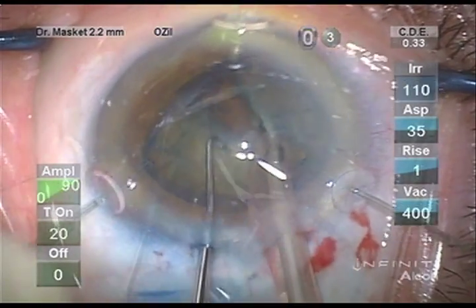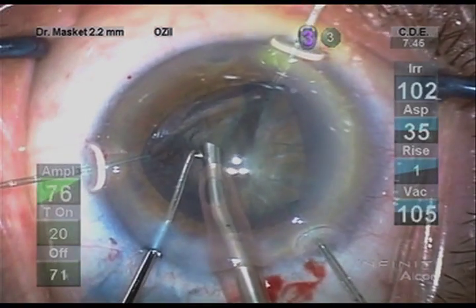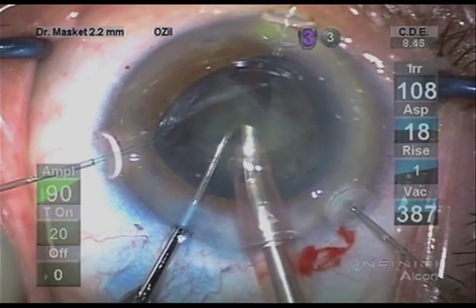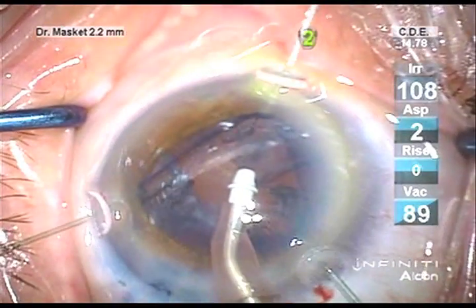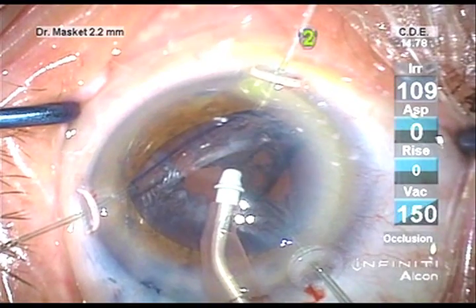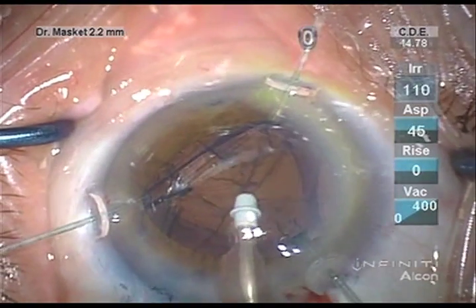Given that the hooks support the capsule, I can perform my standard CHOP phacoemulsification without further weakening of the zonules. Nuclear emulsification is carried out routinely. I opted to use a coaxial cortex removal given its efficiency.